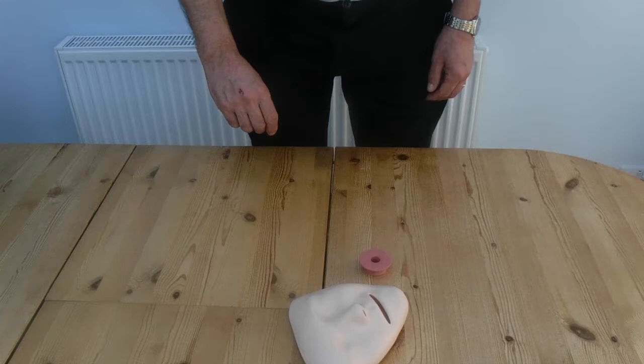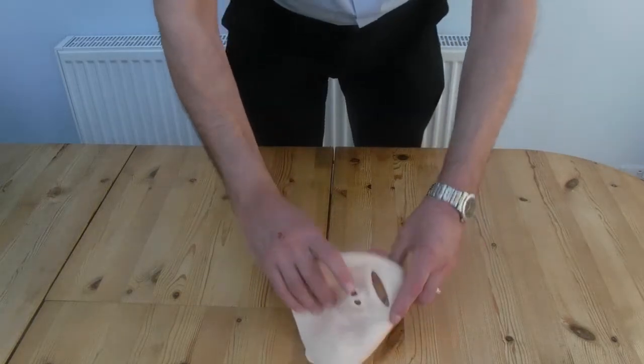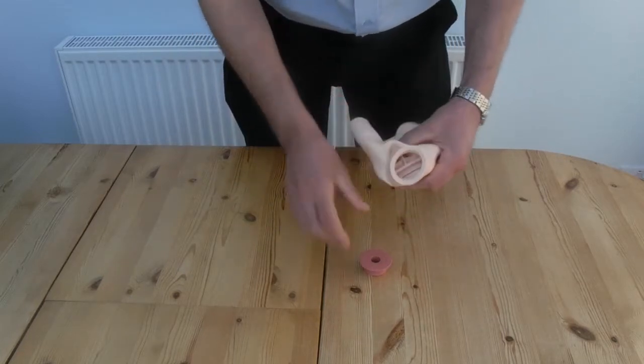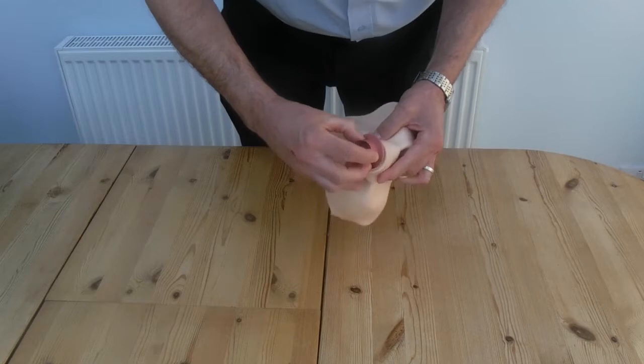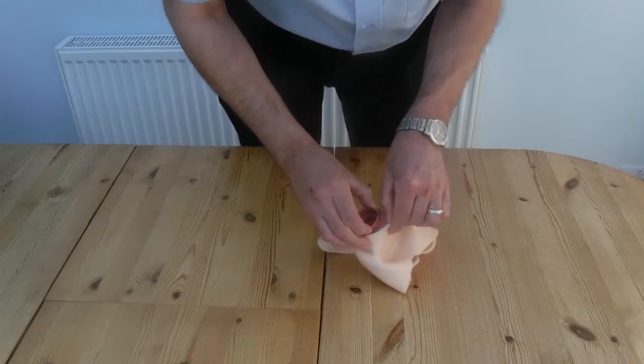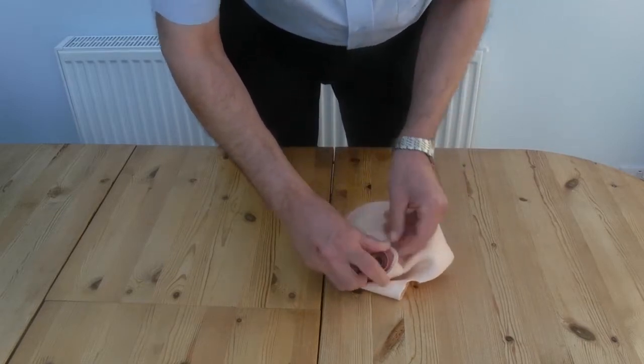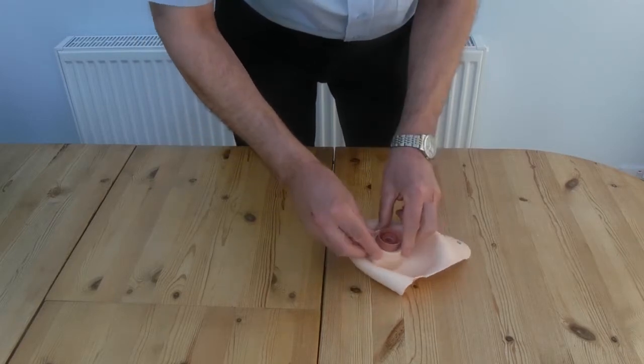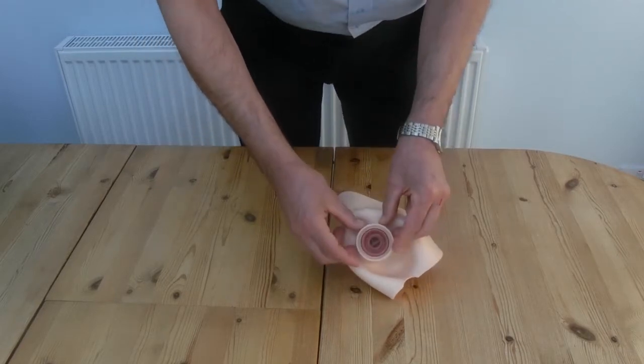Having washed the face and the mouthpiece, we're now going to reassemble those two pieces. It's simply a matter of getting the face, turning it inside out, and there's a recess — just work the latex round, getting it to fit snugly all over the mouthpiece, all the way round. That should be a nice, firm fit, and everything's secure.